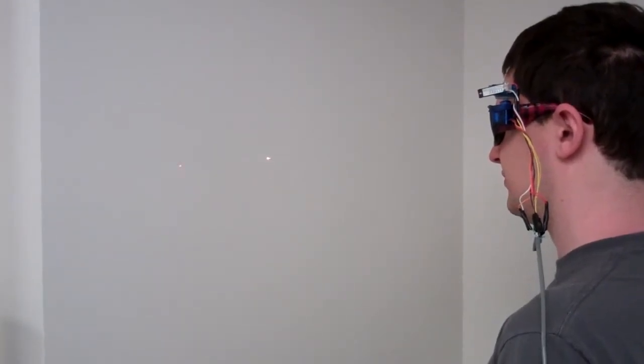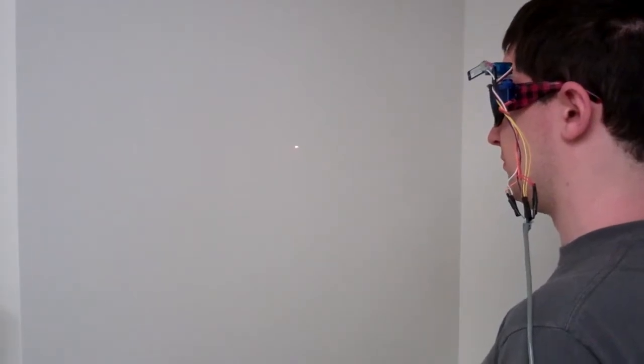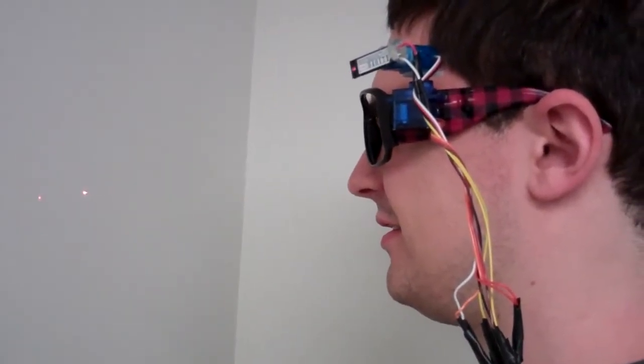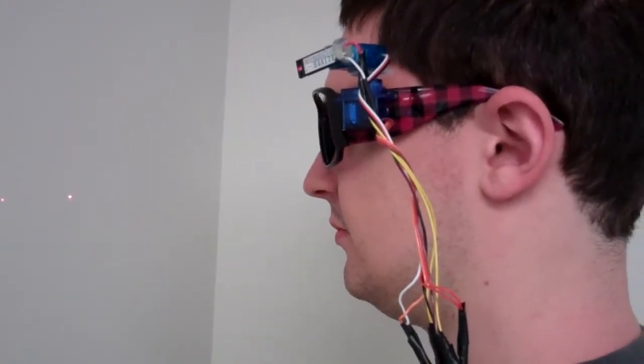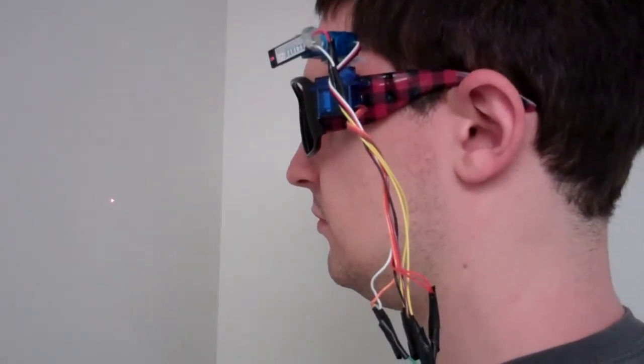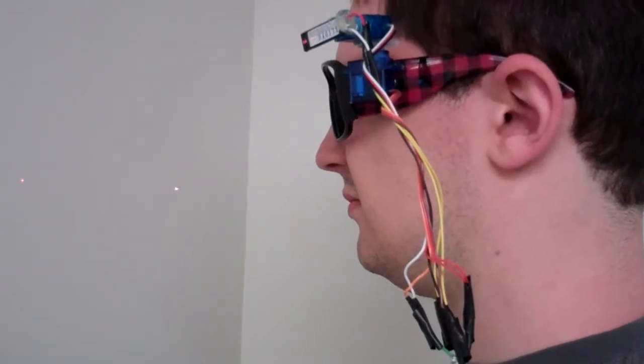Starting the scan now — Joe is going to press the button when the laser goes off the side of his field of view. It turned out to be the incorrect laser, so we'll fix that. Now the left laser should have a blink rate of zero, and the right one should be blinking for this scan. Starting the same scan again.